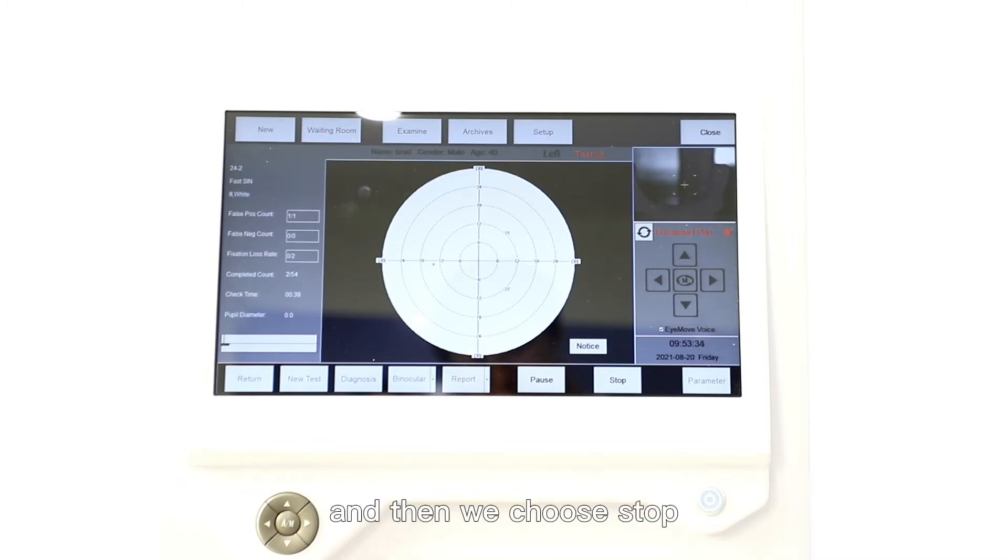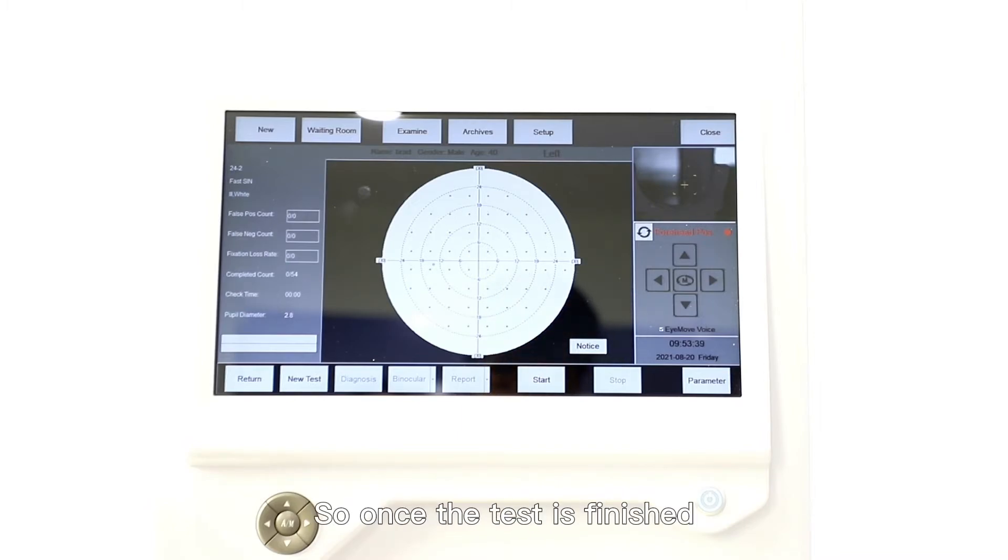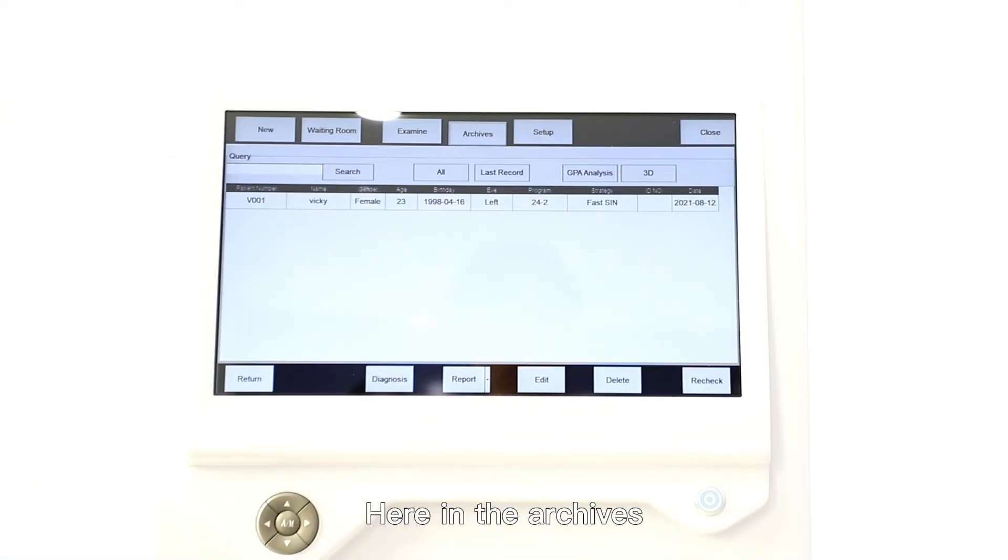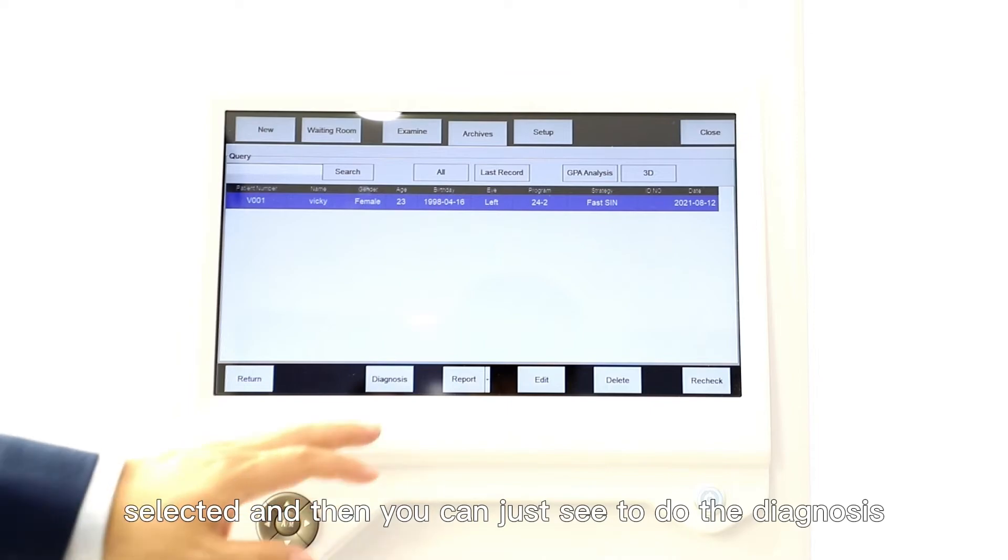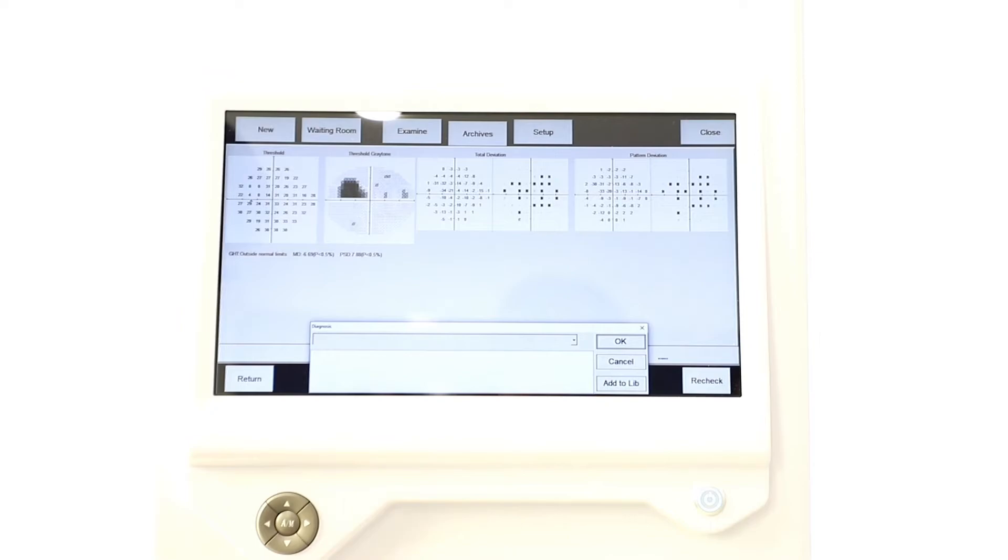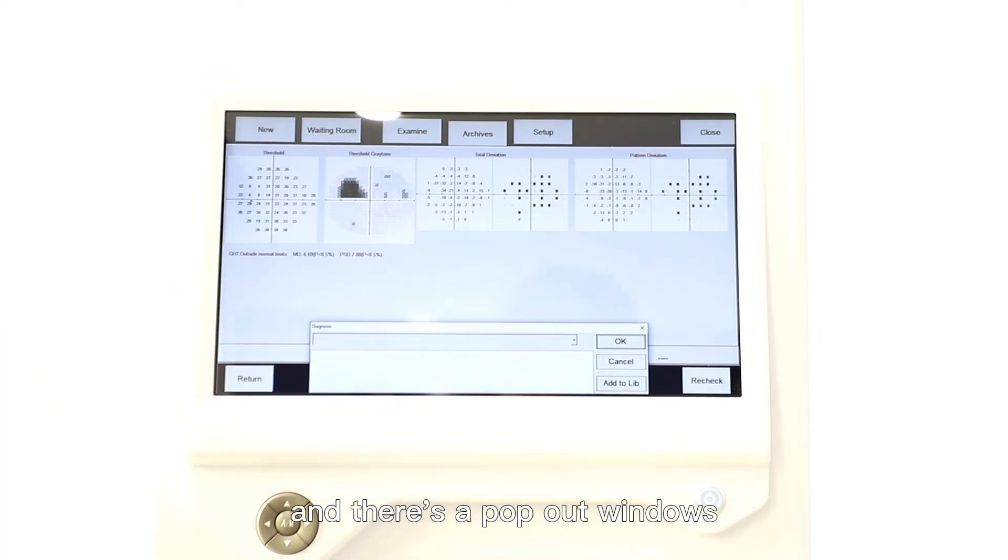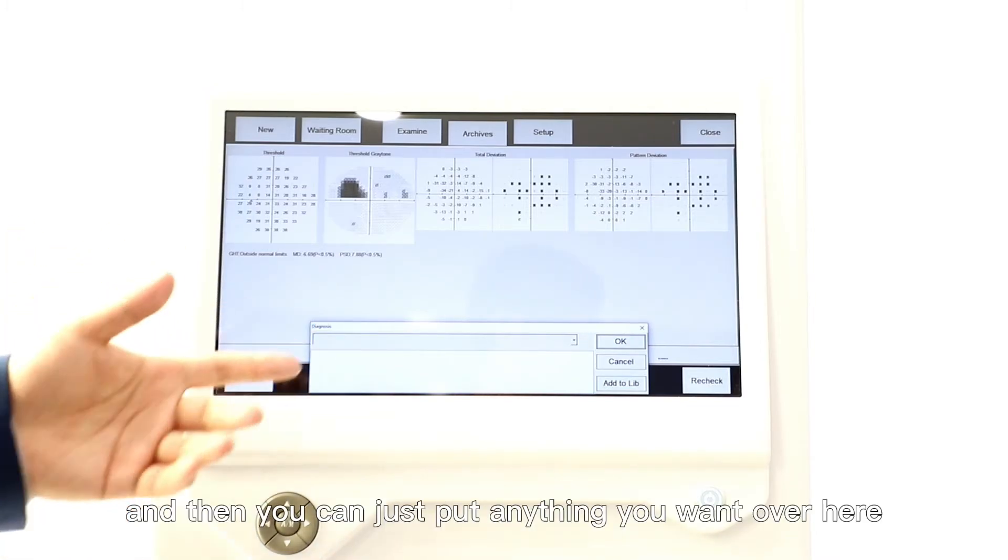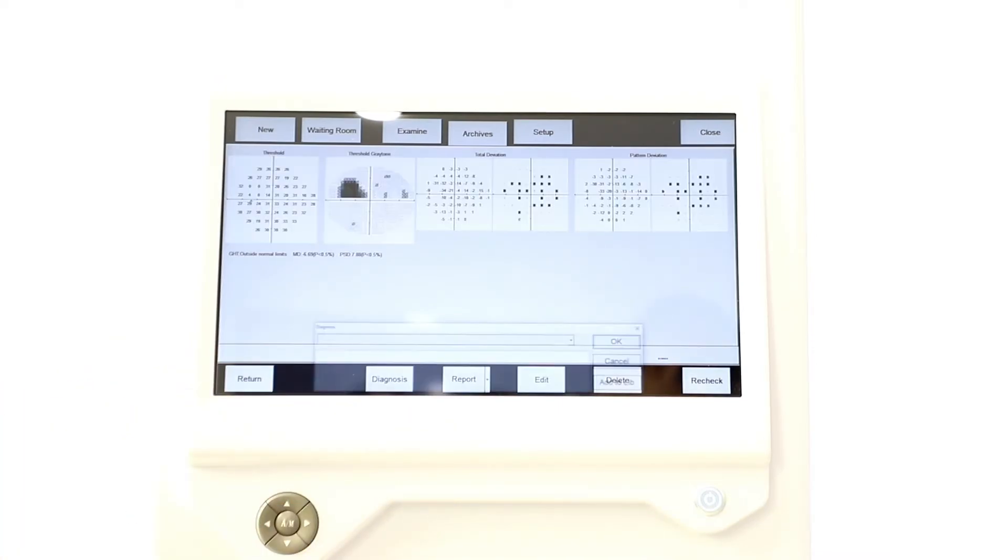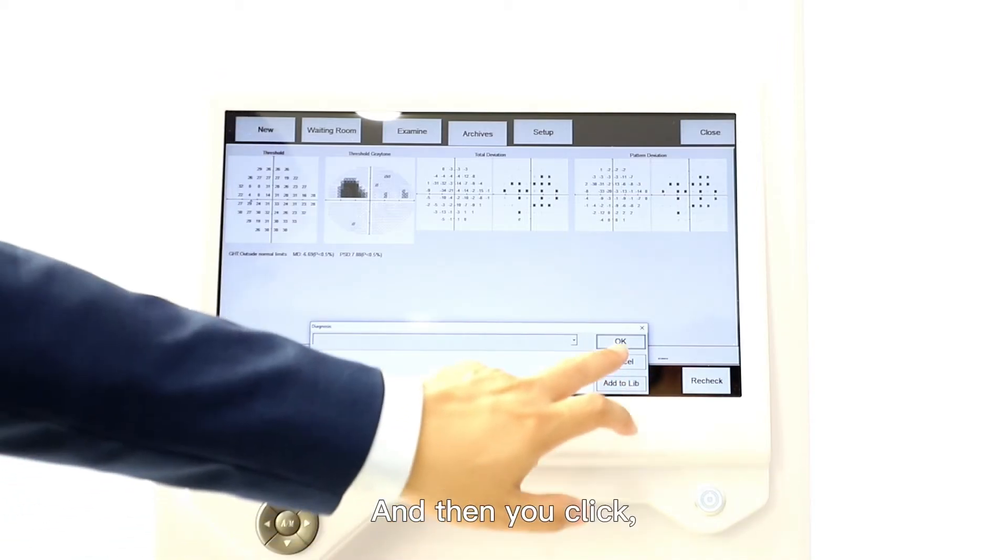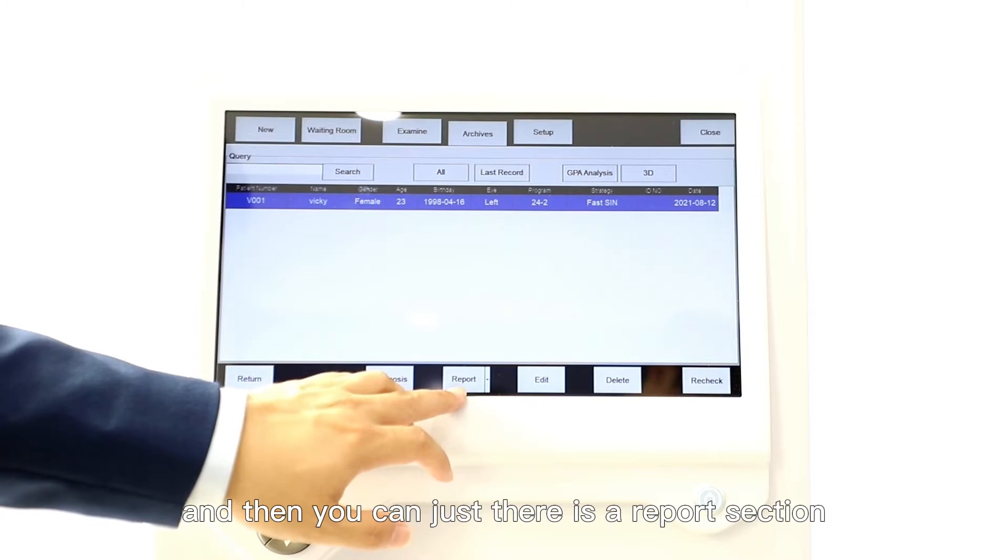Once the test is finished, you can go to the Archives. Here in the archives we have test reports available already. You just select it and then you can see to do the target diagnosis. At the bottom there's a pop-up window so you can enter the diagnosis based on the doctor, and then you can put anything you want over here. Then you click OK.